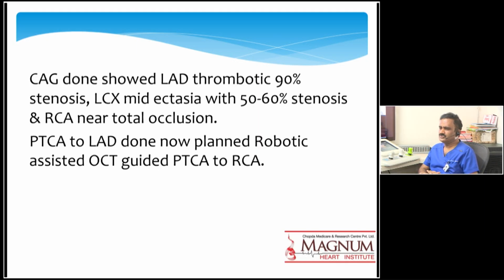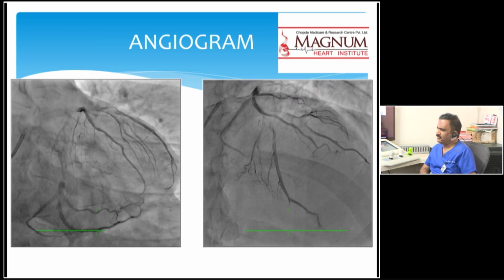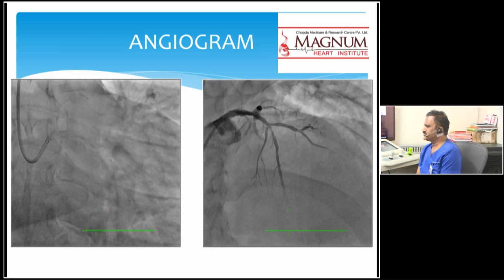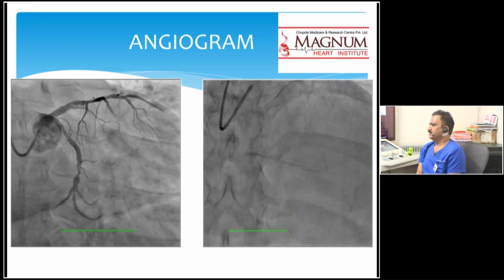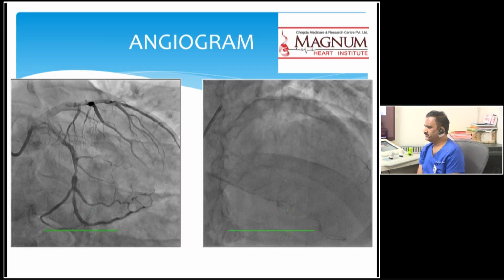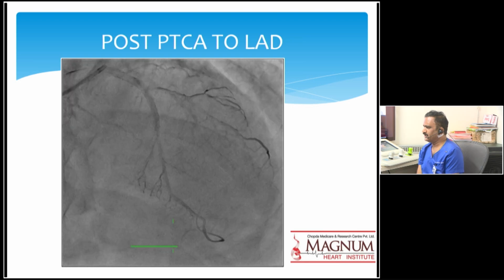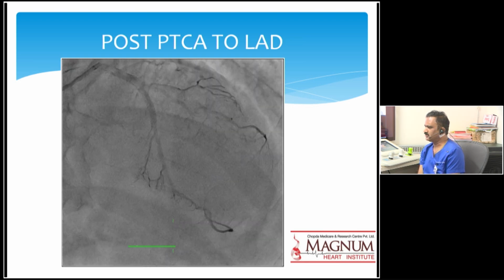If we look at the JCTO score, I'll show you the angiogram. Next. You can see this is LAD, diagonal and the circumflex. In the second view, you can see collaterals filling the PDA, PLV retrogradely in the second view. Next. Again, this is the LAD diagonal. What we did was LAD stenting, provisional, with a kissing of the diagonal, flow good. That's why we accepted the result.